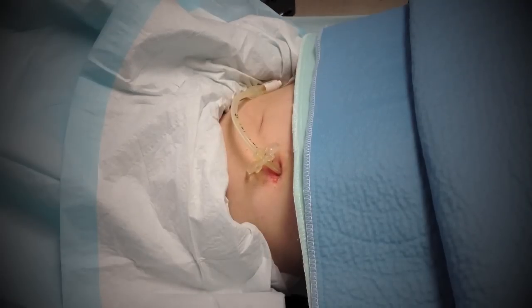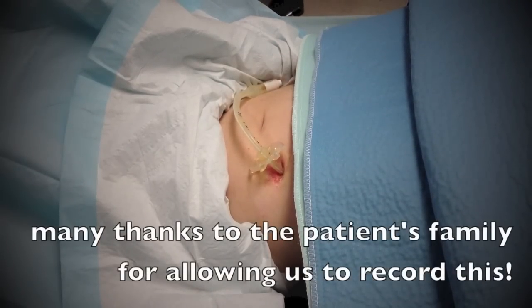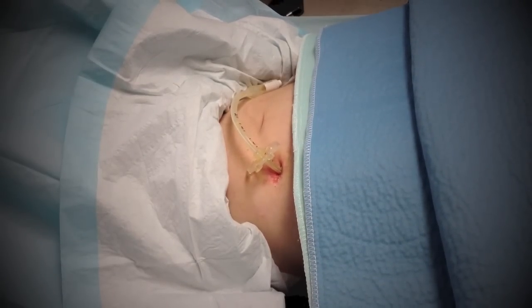The balloon is not inflated right now, so you can just pull it out — there's nothing there on it. I'm surprised it stayed in. I do think some of her seizure medicine was leaked out.